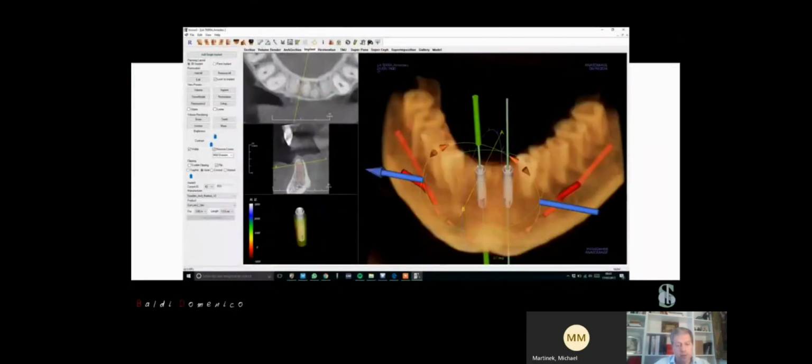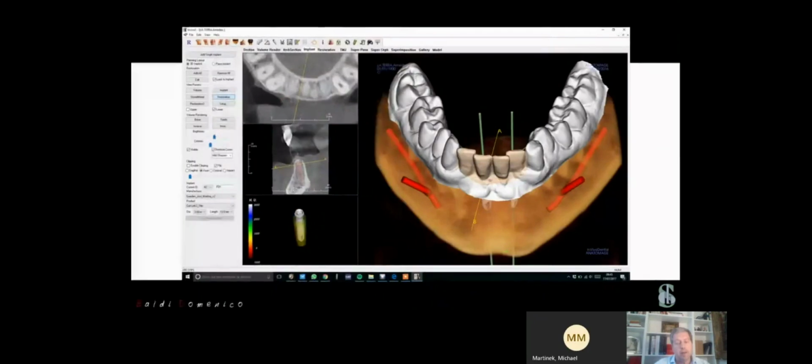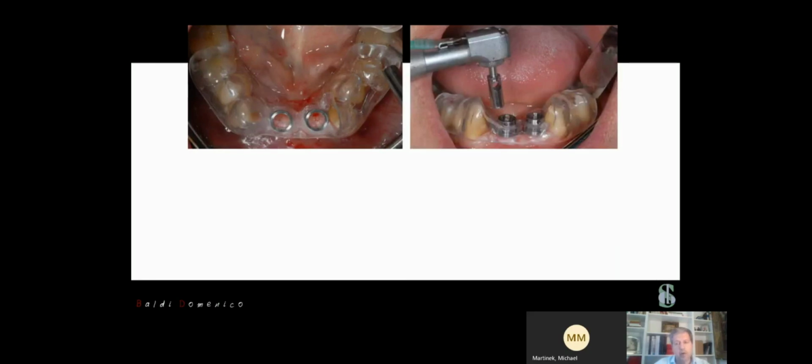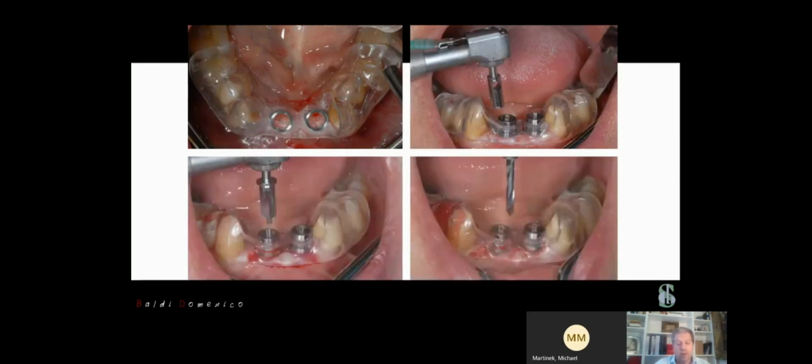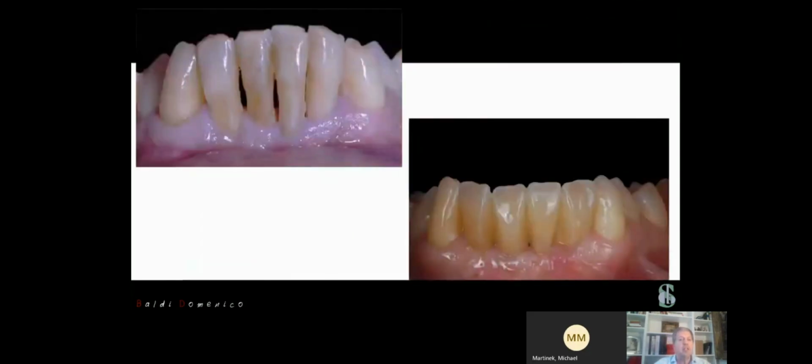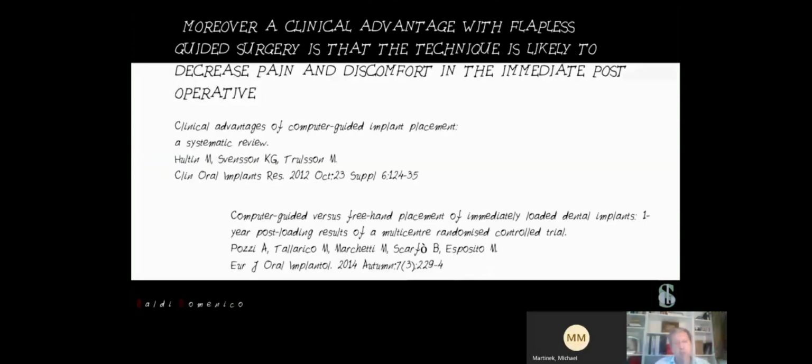So we plan our surgery, and then we plan a workshop, a virtual workshop, of course, and then we make a model and a guided surgery. And after that we work on our patient, in order to be less invasive, using this surgical guide, and then using this narrow implant, the 3mm implant, that permits us to be less invasive and to finish our work in a good way.